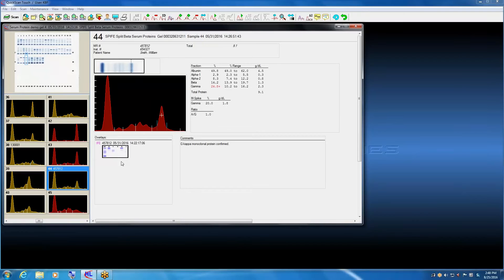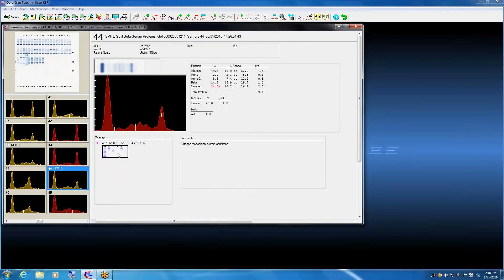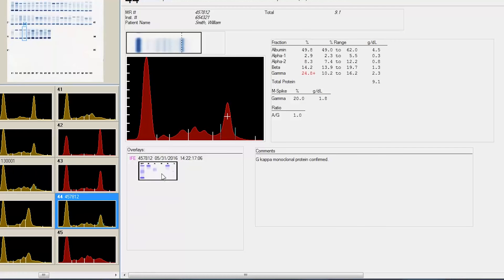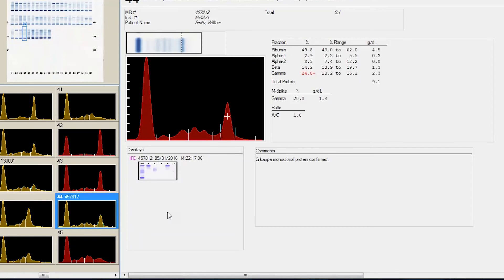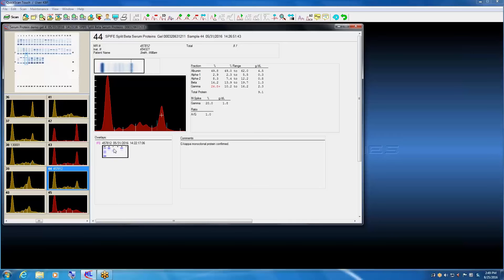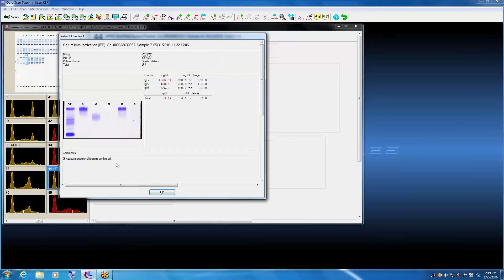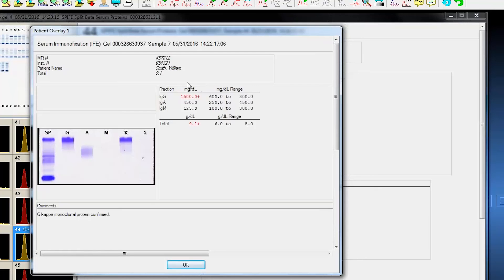Another feature I want you to notice is there's an IFE thumbnail. The software searches the database when this protein is scanned, and it looks for either serum immunofixation, urine immunofixation, or a previous urine protein sample, and has the ability to apply them as thumbnails. The nice part about this thumbnail is that I can click on it, enlarge it.